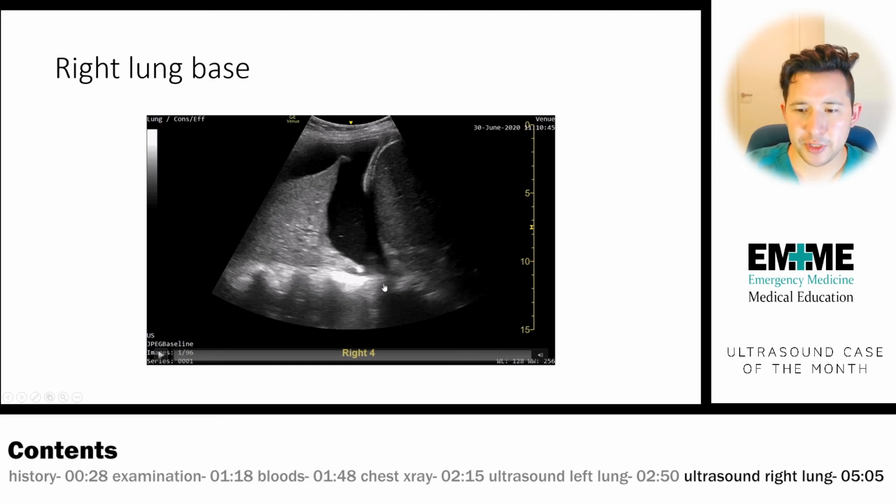We have some transverse processes of the spine at the bottom of the image, and these continue up above the diaphragm, which is an abnormal finding. And the reason that we can see these bones so clearly on this view is that above the diaphragm, we have this area of fluid density material, which is this large black area. And then above the black area of a likely effusion, we have this area of lung.